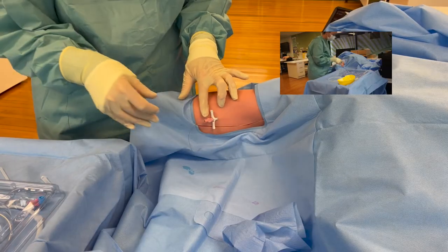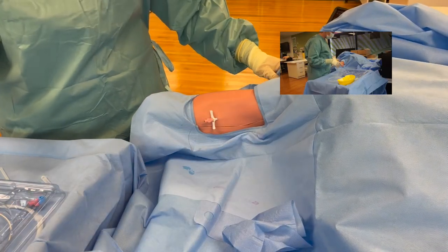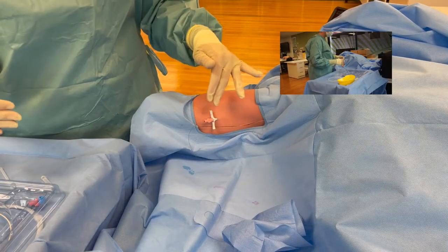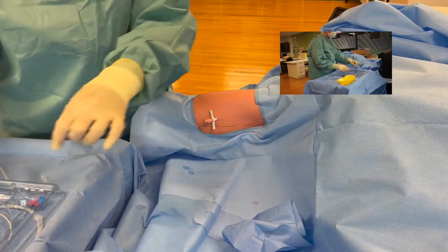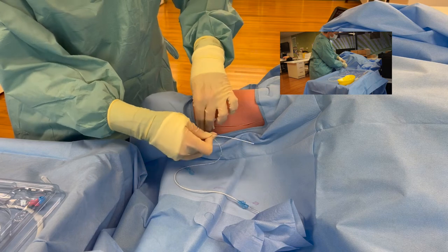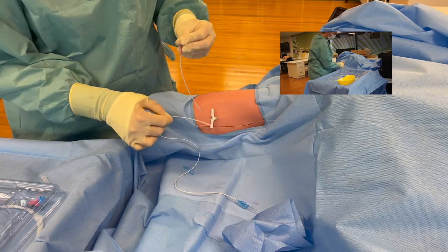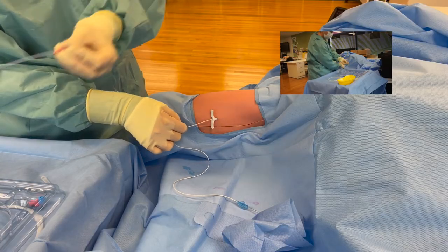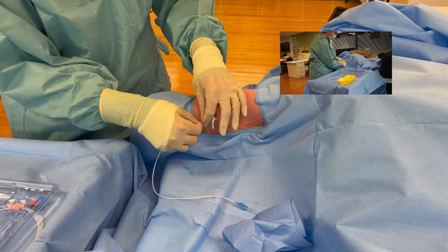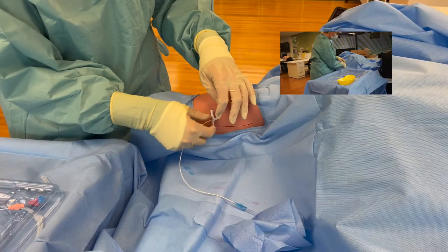At this point, if you're using a tourniquet you can release that, because you do not need to engorge the vein - the dilator will hold the vein open for you. Bring your PICC line close. Be prepared for blood to come out of your internal introducer and dilator, so just pop that on your working surface. You're going to feed your PICC line in - it should flow or slide in nice and easily.